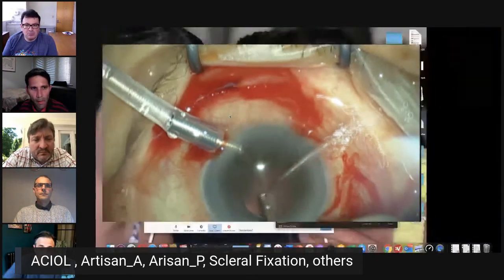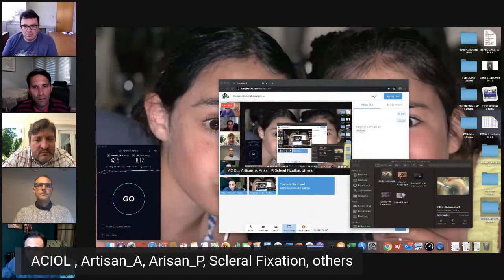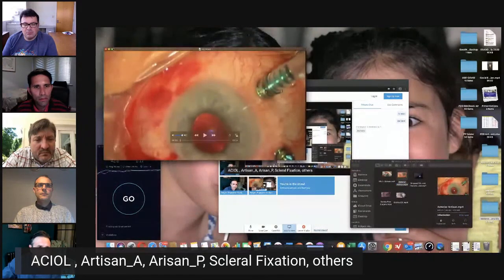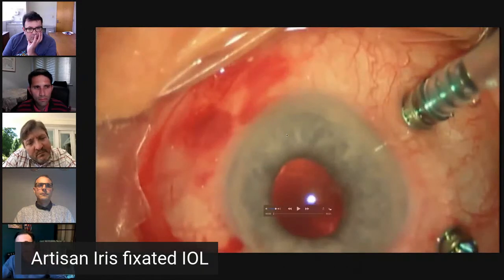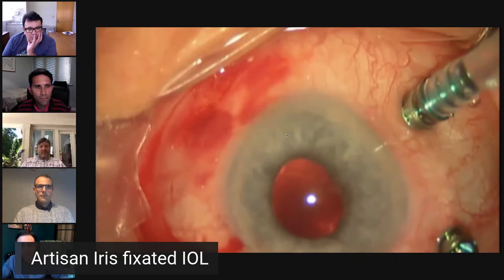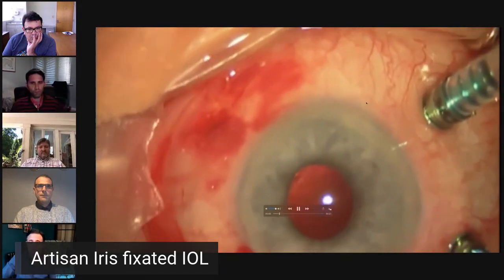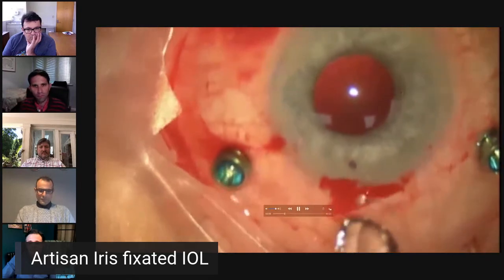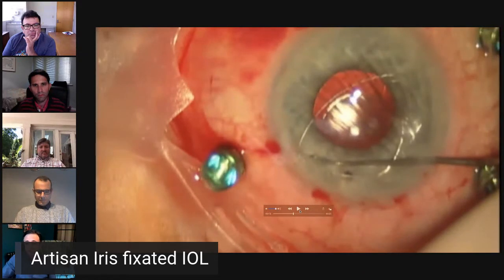So next, I'm going to show you something that I don't do that much anymore, because, as you mentioned, I prefer always to go behind the iris because it's the most anatomical position and it's near the nodal point and the clearest images that the eye will get are in that position. So this is an anterior chamber clipped lens, an Artisan lens. It's a simple procedure to get the lens in. Remember also, as we mentioned, to have a wide, big wound, about 5.5 millimeters.